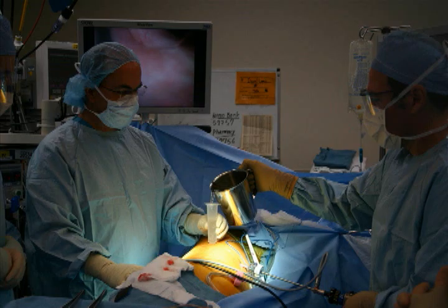Two 5mm trocars are placed into the right chest. One is in the submammary crease in the anterior axillary line, through which insufflation to 8 mm of mercury was used to create a pneumothorax. You can see the 5mm videoscope introduced, visualizing the inside of the chest.